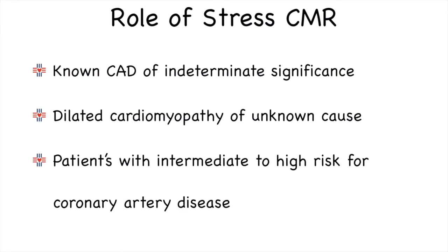Who should be having stress cardiac MR? Well, patients who have known coronary artery disease of indeterminate significance, for example, a patient who has a 70% or 80% stenosis with atypical symptoms, or patients who present for the first time with dilated cardiomyopathy of unknown cause, whereby coronary artery disease is one possibility. Stress MR is excellent in these patients because it will not only exclude or diagnose coronary artery disease, but it will also look for non-ischemic causes of dilated cardiomyopathy.